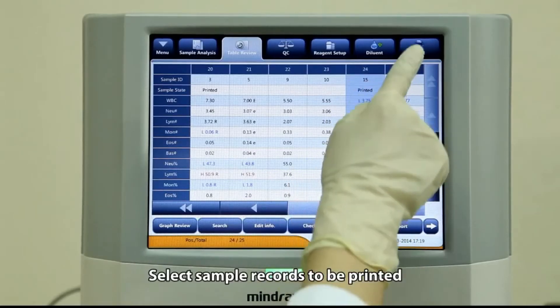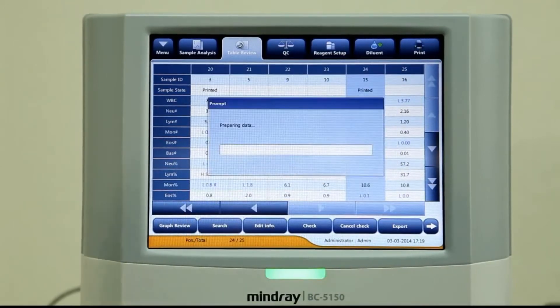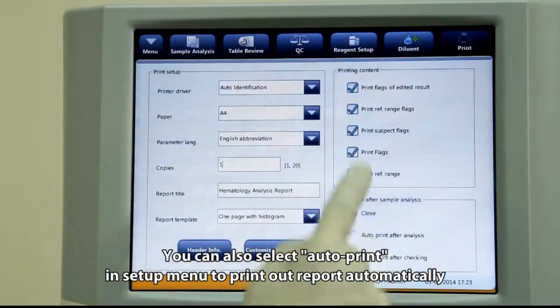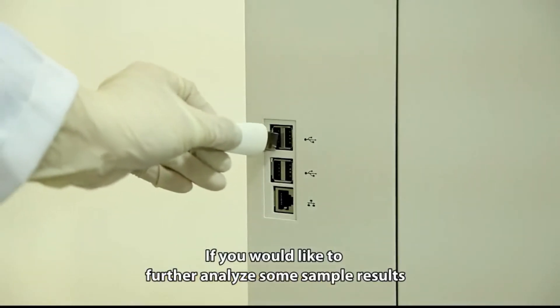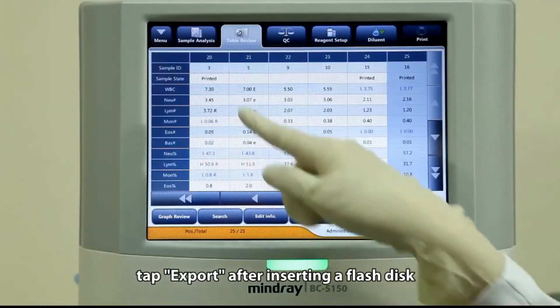Select sample records to be printed and then tap print. You can also select auto print in the setup menu to print reports automatically. To further analyze some sample results, tap export after inserting a flash disk.